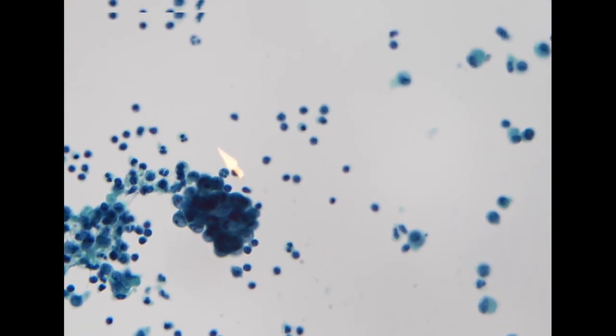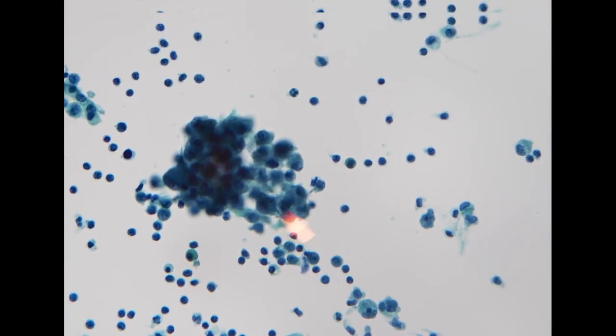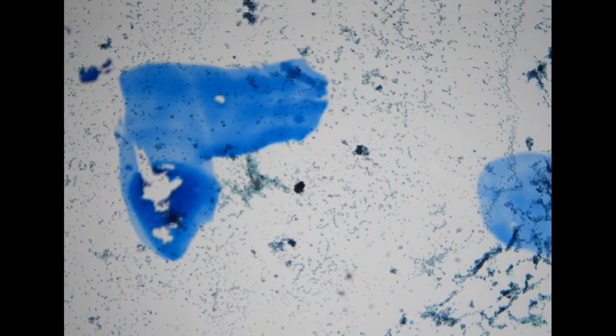And another tight cluster, this is also likely an adenocarcinoma. It is relatively uncertain whether these are mesothelial cells, but this is definitely an adenocarcinoma. The patient seems to have a high-grade serous ovarian cancer despite her younger age. So we will call this specimen positive for adenocarcinoma.